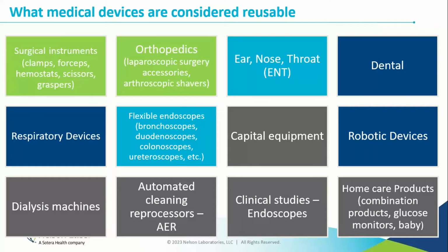Dialysis machines, we're seeing a lot of traction in those areas. Anything that's a water irrigation device, we're seeing regulatory asking for validations for that. That's also your air purifiers or your humidifiers that you have in the hospital. You may just take the water out and replace it, but you have to have a disinfection cycle, because over time in a healthcare facility, if you have stagnant water just sitting around, you will start to have a buildup of organisms.